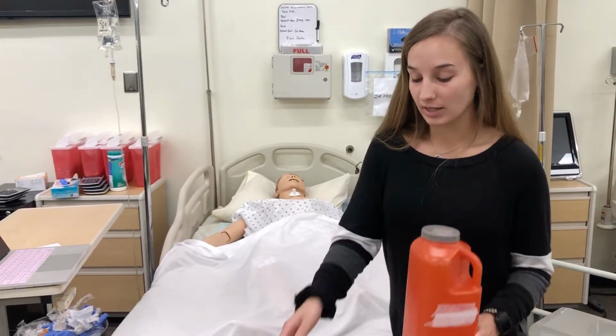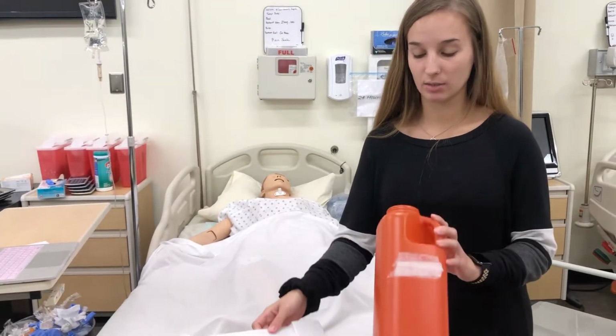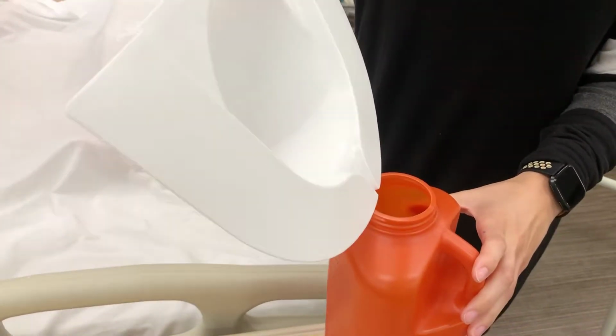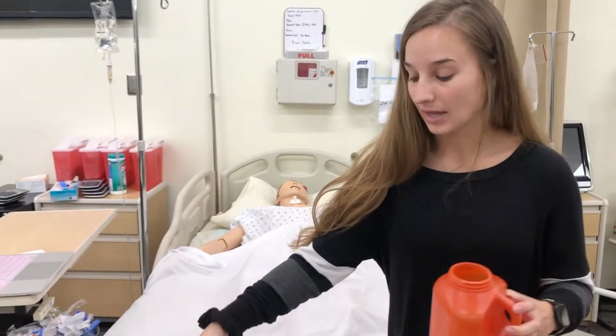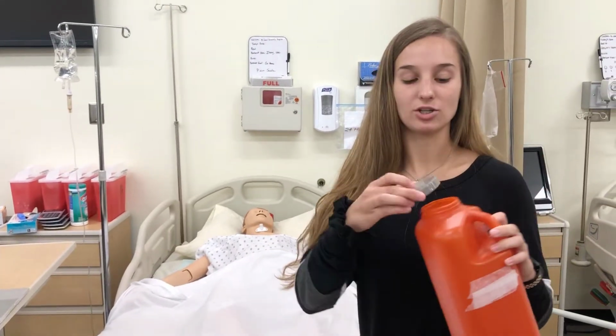So basically that's all. A way that I would put the urine into the basin is, once the urine is collected, I would easily just use this funnel to pour it into there. And this holds 3,000 milliliters. So within 24 hours, I should be able to fill this up from the patient.